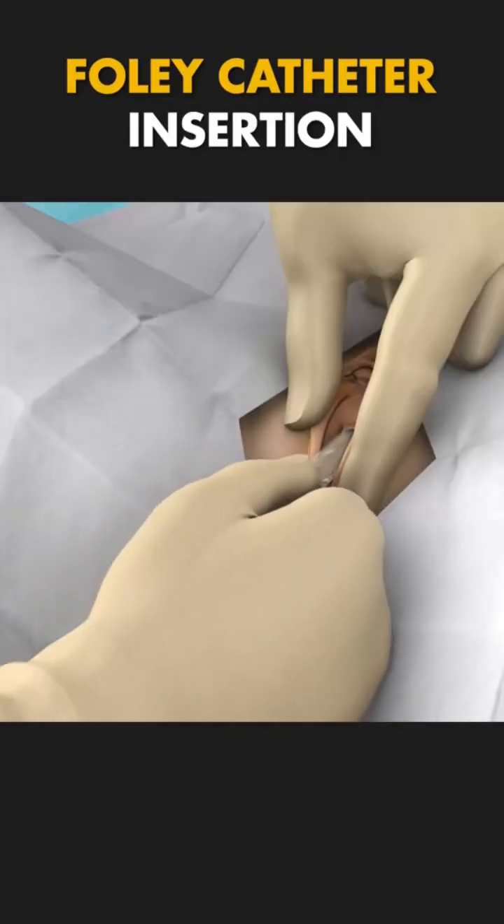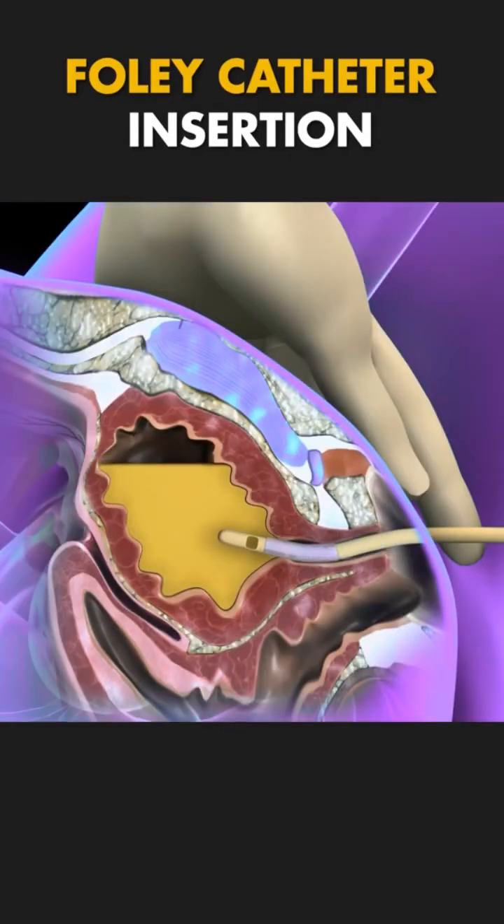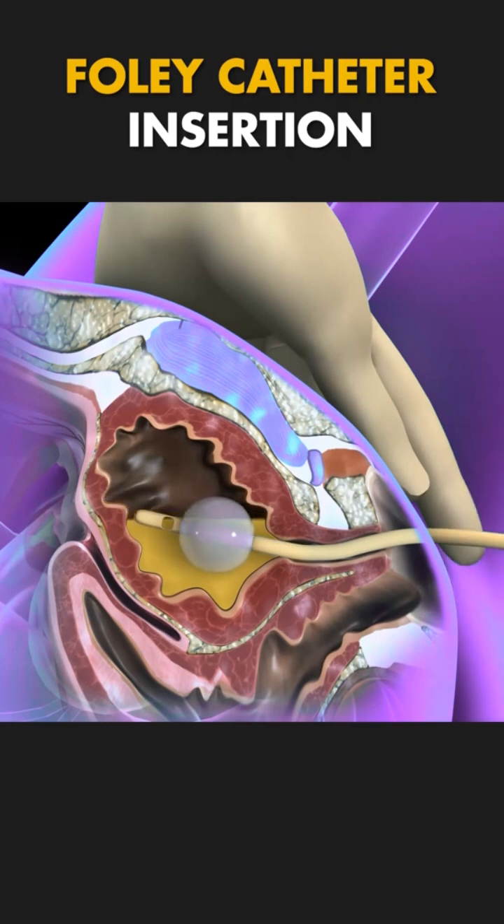Ever wondered how a Foley catheter is inserted into the female body? Let's break it down. A Foley catheter is a thin, flexible tube used to drain urine from the bladder.